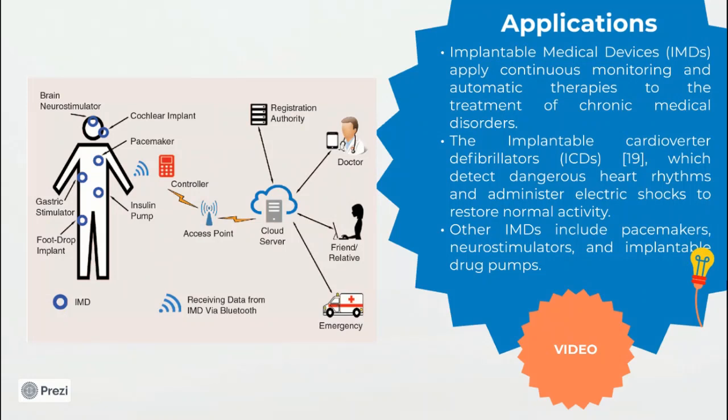Applications: implantable medical devices (IMDs) apply continuous monitoring and automatic therapies to the treatment of chronic medical disorders, like the implantable cardioverter defibrillators (ICDs), which detect dangerous heart rhythms and administer electrical shocks to restore normal activity. Other IMDs include pacemakers, neurostimulators, and implantable drug pumps.